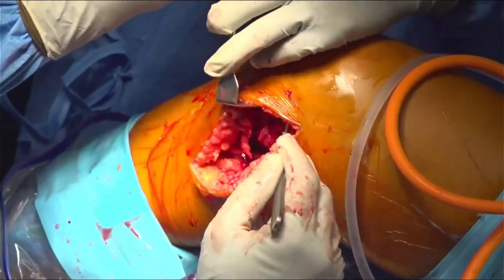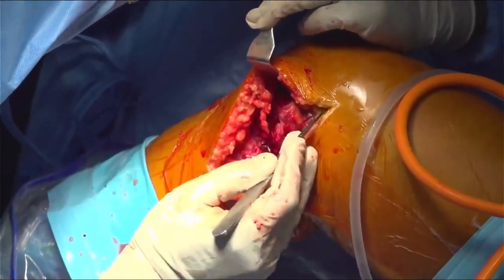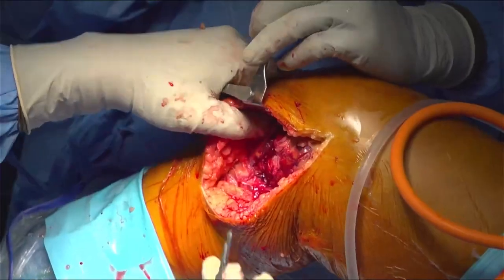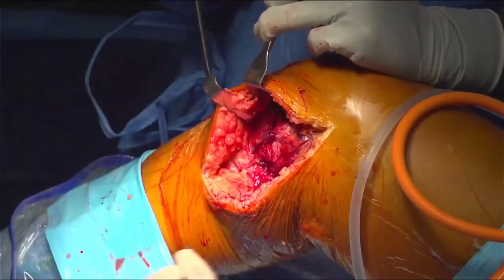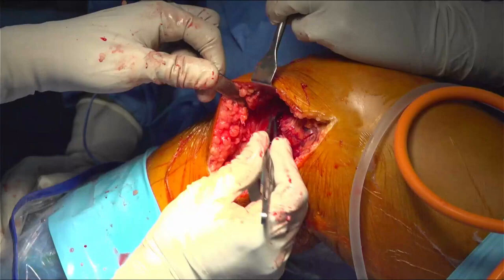Knife please. So this is okay. Hold this. If you can appreciate here, this is the anterior part of the MCL which is torn.